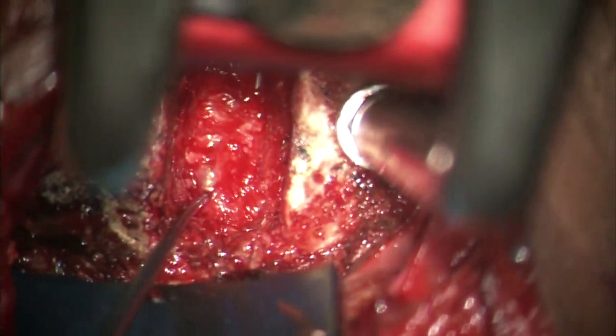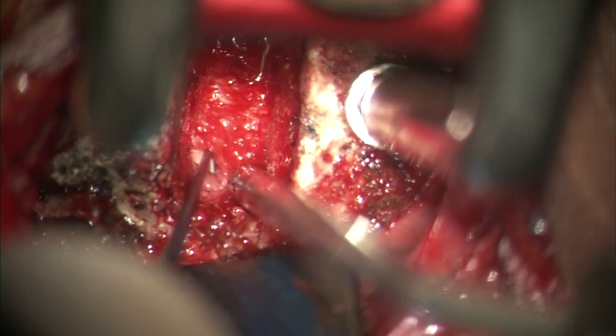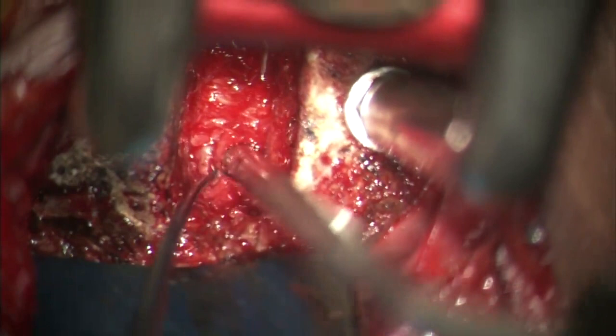To perform the PLL takedown, a nerve hook is used to elevate the PLL off the dura and the PLL is incised using a number 15 blade. Note that it is not mandatory to perform it in all cases; we prefer to do it when we suspect herniation of the disc fragment behind the PLL.